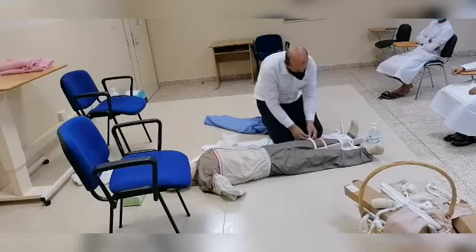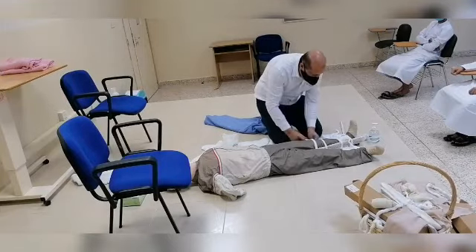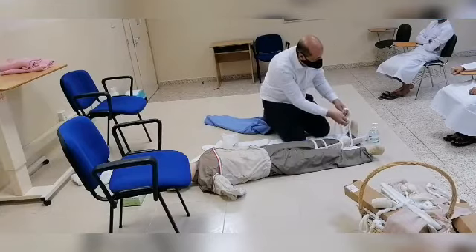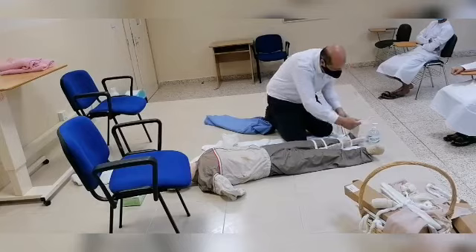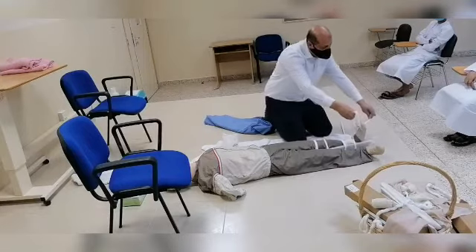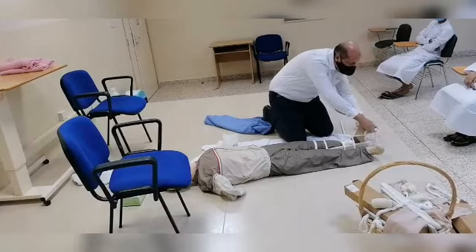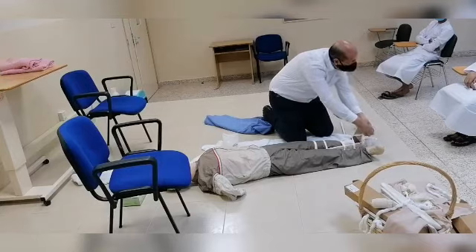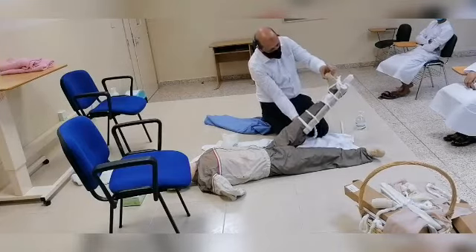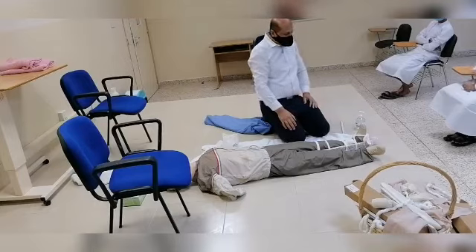I will come back to this binder and fix it permanently. Then I will come to the one at the ankle joint and fix it permanently. I will make a figure-of-eight, like this, keeping the foot in a right angle. So by that, the leg is fixed. This is the hard splint.